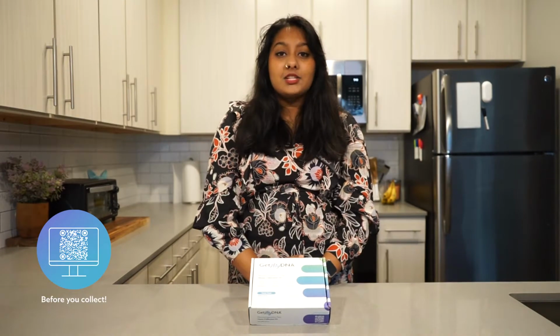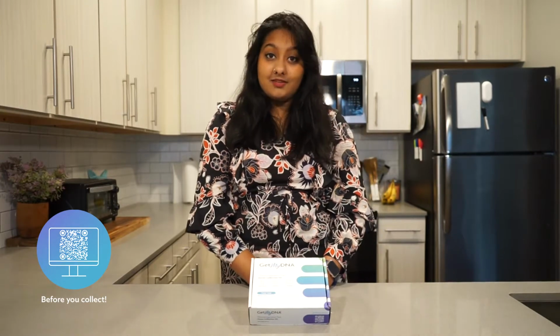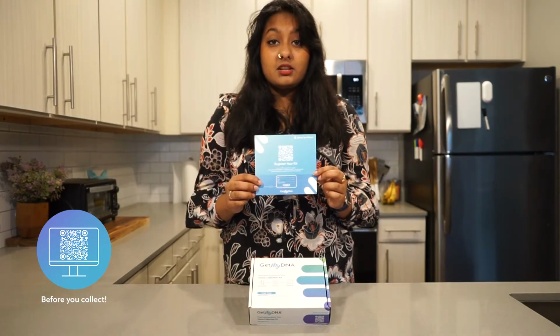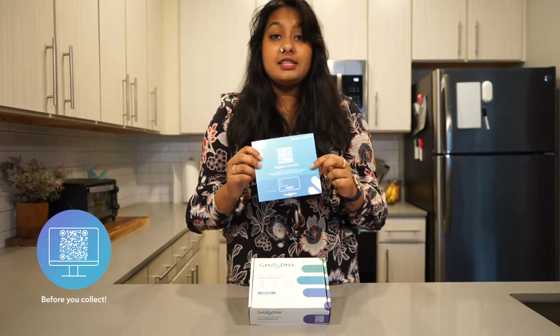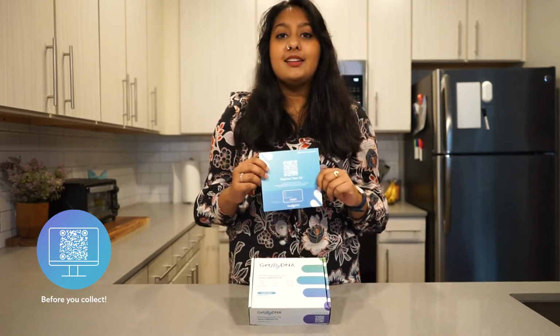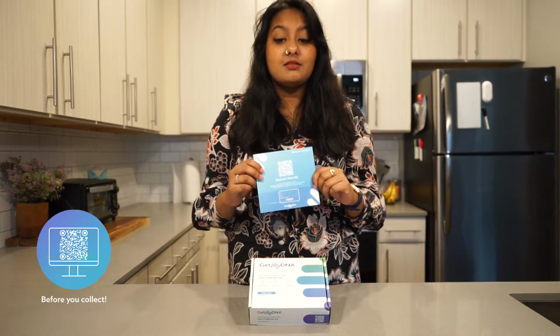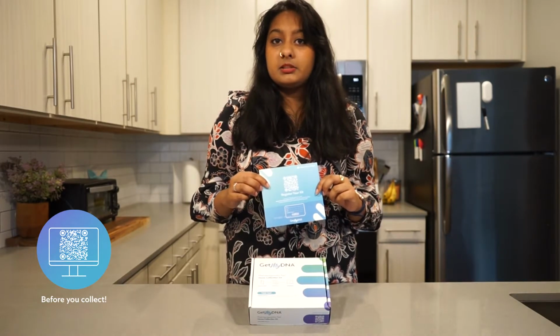Before you start the collection process, you must register your kit online. The lab cannot process your sample unless your kit has been registered online. Your kit includes a registration card on how to register your kit. To register your kit online, you can scan the QR code here on the registration card or go to getmydna.com/register. You can locate your kit registration code on the sticker label included.